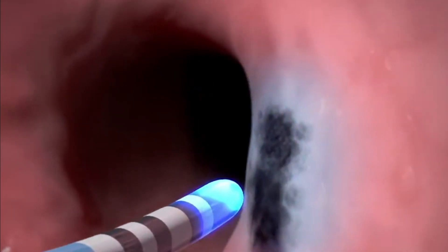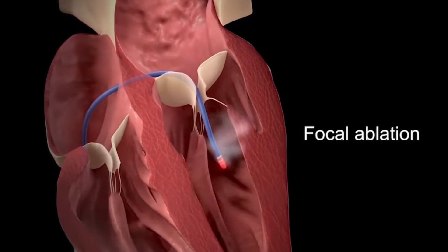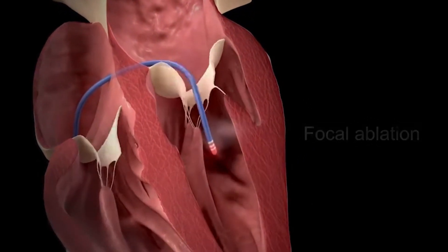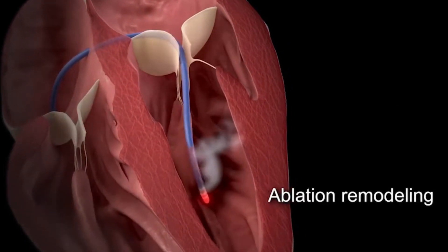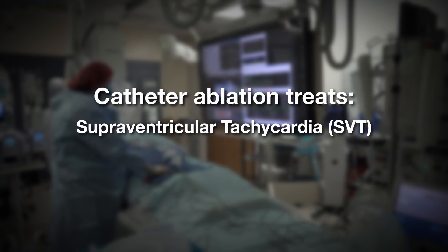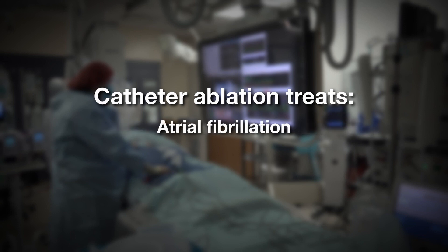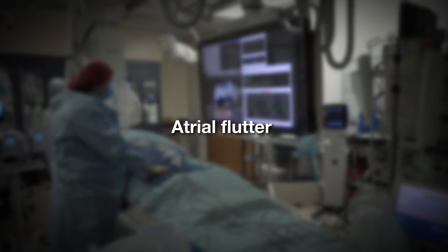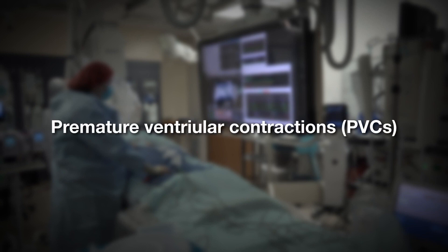You will probably be awake during the procedure, but you might be asleep. The doctor will give you medicine to help you feel relaxed and to numb the areas where the catheters go in. An EP study and ablation can take 2 to 6 hours, and in rare cases longer. If you have an EP study only and don't need more treatment, you may go home the same day. But if you have ablation, you may stay overnight in the hospital. How long you stay depends on the type of ablation you have.